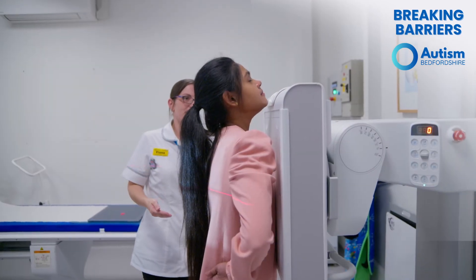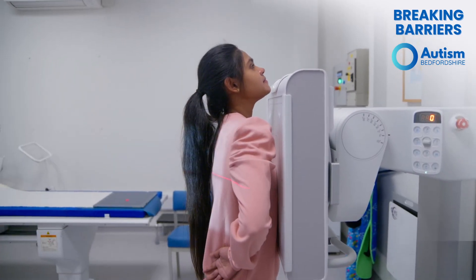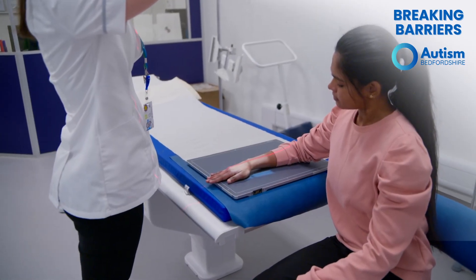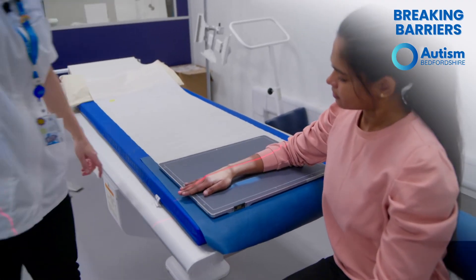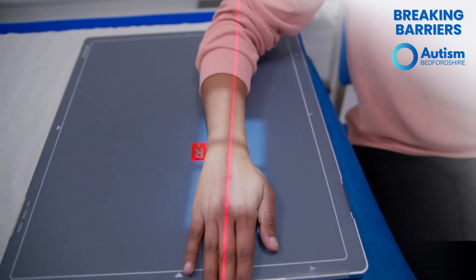If you are having your chest x-rayed, you may be standing up. If you are having your wrist, hands, fingers, forearm or elbow x-rayed, you may be sitting in a chair. The radiographer may place one of these markers next to the body part being x-rayed, so the doctor who looks at the x-rays will know if it is your right or left side.